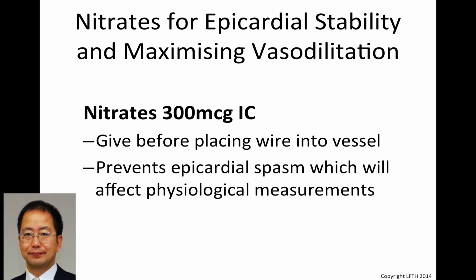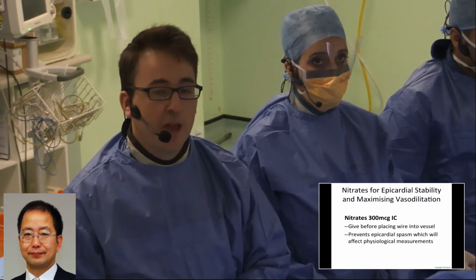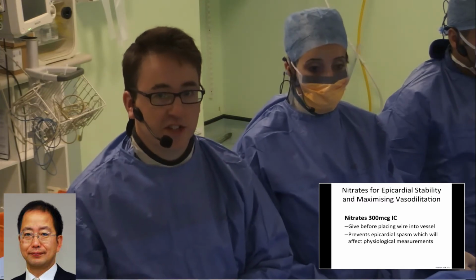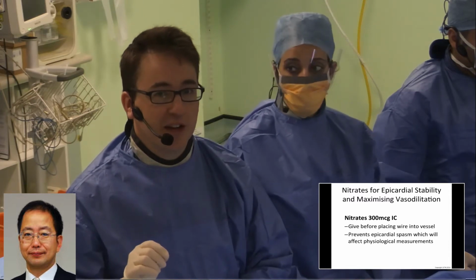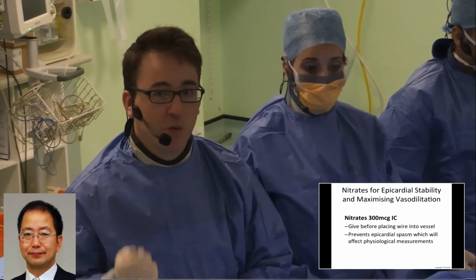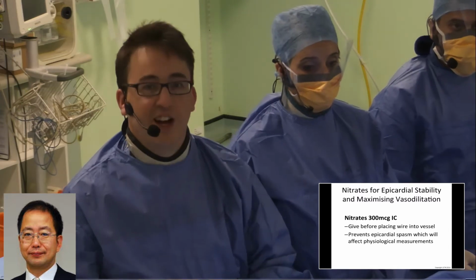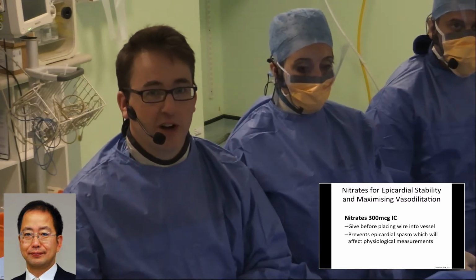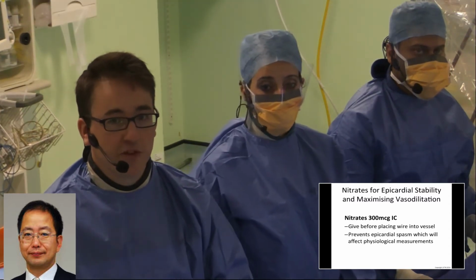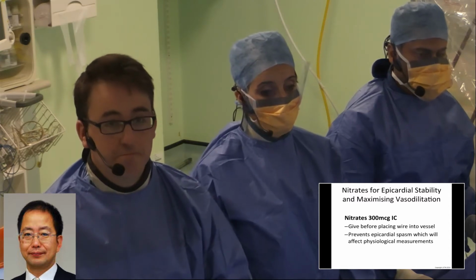I would, because I think there are two reasons. One, it takes a few minutes for the maximum epicardial diameter to be achieved. If you give nitrates, you're going to induce very mild hyperemia. That takes 20 or 30 seconds to dissipate. And then also, it's like everything in medicine: prevention is better than cure. So if we can prevent spasm from the wire, it's better to do it than to try and fix it once the spasm has occurred. Because, as you know, sometimes if you get spasm from the wire, we can't be 100% certain, even after giving nitrates, that it's completely resolved. So that's why I'd always give the nitrates, or recommend giving the nitrates, up front.